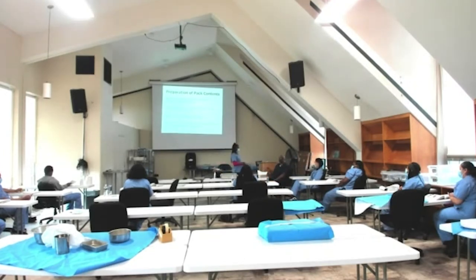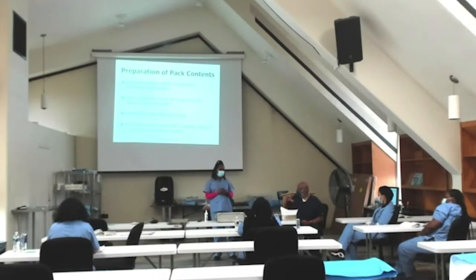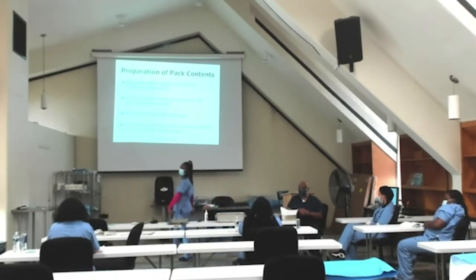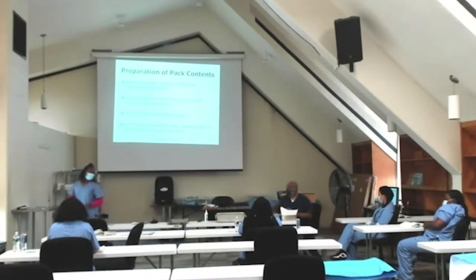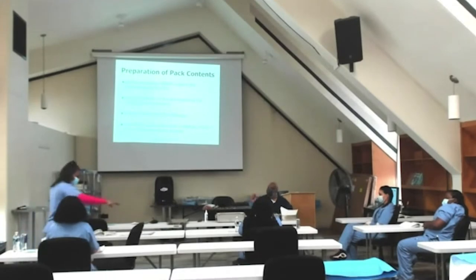And it is correct. Now, Jessica is assembling this set, and if she does this with all her instruments, just like all of you, she's checking for debris. At your workstation, you've got a light and you've got it on. You have some type of magnifying device, and you're making sure, and then you're noticing, this sure is stiff. That's when she would apply it. Yeah, the milk. And then just keep it moving.